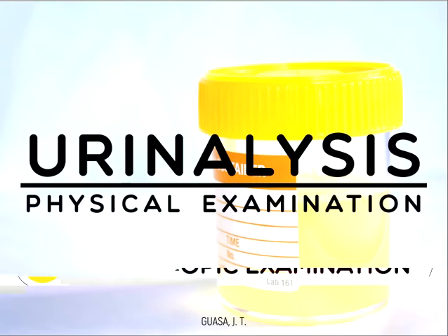But first, why do we analyze urine? Urinalysis is always requested in the labs, along with fecalysis, because urine is readily available and easily collected. We talked about the previous lesson, the midstream and the clean catch, and then a random urine specimen is also possible.